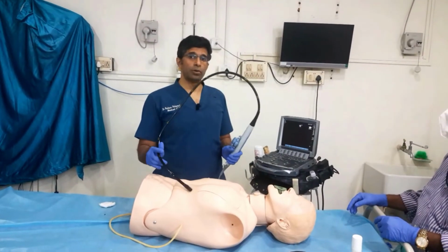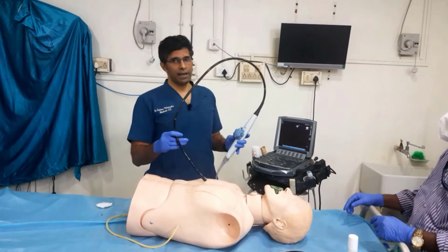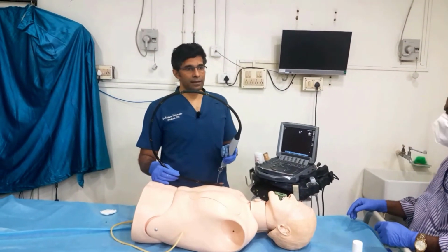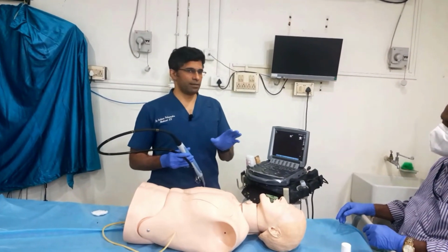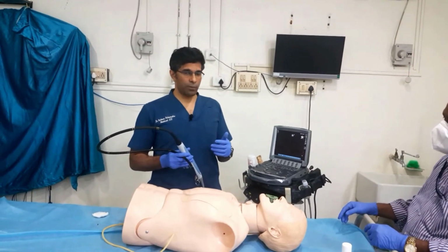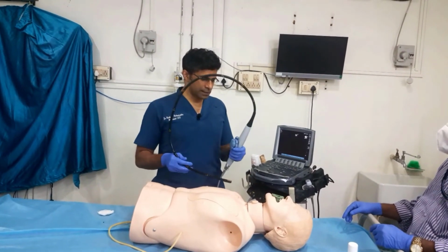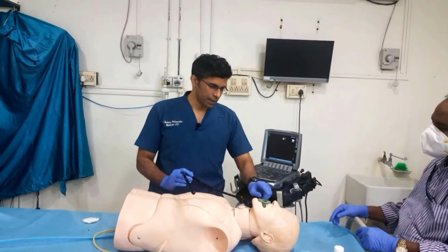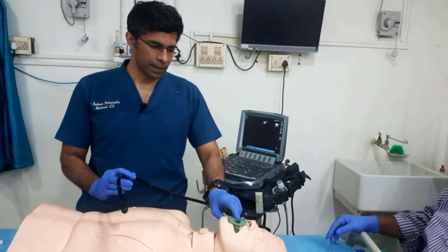Okay, we will now look at how to insert the transesophageal echo probe. Now, in the ICU, most patients are going to be intubated and sedated, and so it is important, first of all, to make sure that the ET tube is well secured. Second, we may want to increase the sedation in case the patient is very awake, so that it is painless for the patient. Now, to insert this, we must take care to use a bite guard so that the patient does not bite down on this very expensive probe.